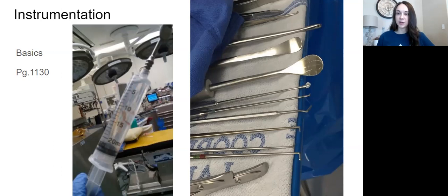So it starts talking about pituitary rongeurs. So you know pituitary rongeur in ENT is called a Takahashi forceps. Remember, it's the same instrument, it just has a different name. So your pituitary rongeurs are still rongeurs. They're going to be able to take big grasps and bites, but pituitary rongeurs are usually used for softer tissue. So in cranies, they can be used to take out tumor. In endonasal cases, they're used to take out tumor. In spine, they're used to take out pieces of disc because it's softer. And that disc, to me, looks like little pieces of crab meat. It's very soft and fragile compared to these big pieces of bone.